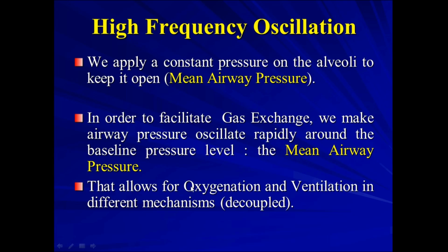On conventional mechanical ventilation, if you apply some setting to improve oxygenation like PEEP, ventilation might be affected, and if you apply some change on ventilation like applying higher or lower tidal volume, oxygenation might be affected as well. Here in this machine, it's decoupled. Ventilation is different than oxygenation, different mechanisms.